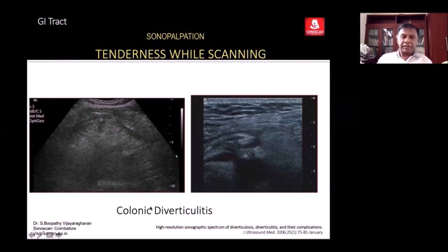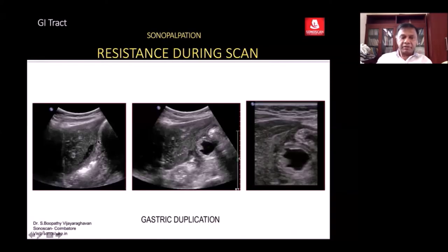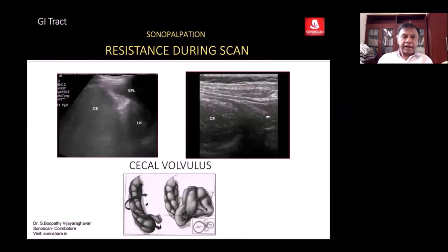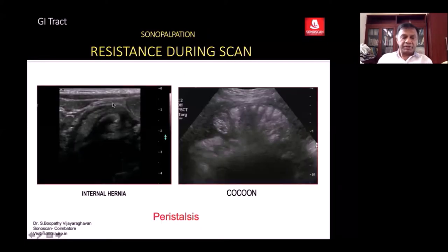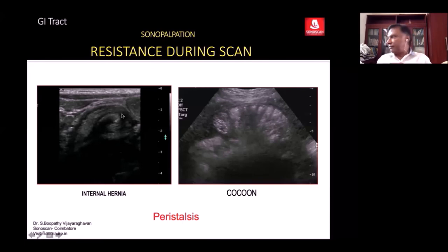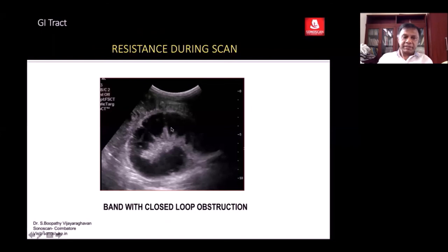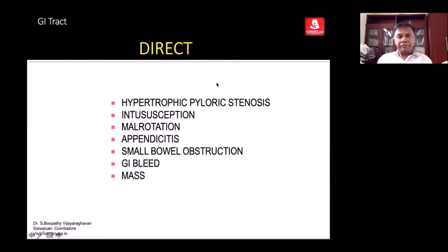This is the typical appearance of epiploic appendagitis. For colonic diverticulitis, again in the left iliac fossa, you see the normal colon with fever. When there was resistance in the left hypochondrium, scan showed a large fluid-distended and gas-filled paracolic area. You see a mass of collapsed loops with bubbles, as if the collapsed loops are within a bag, acutely distended.